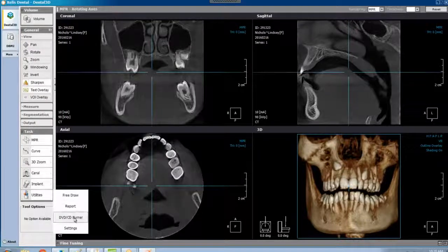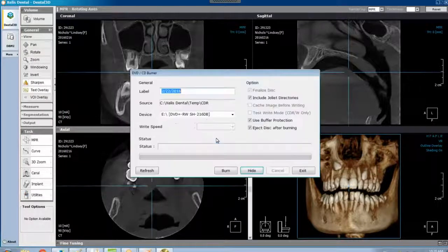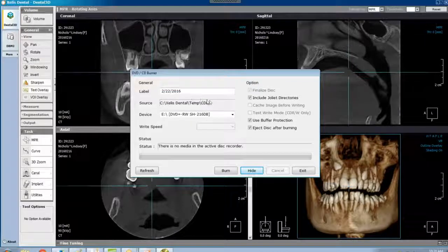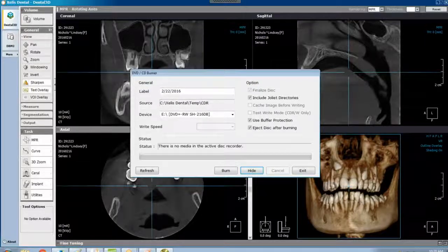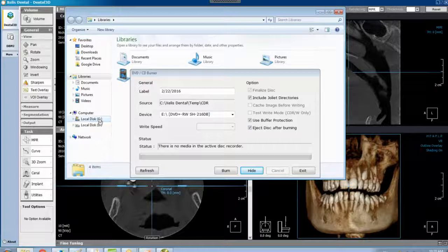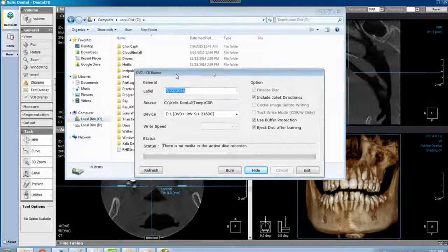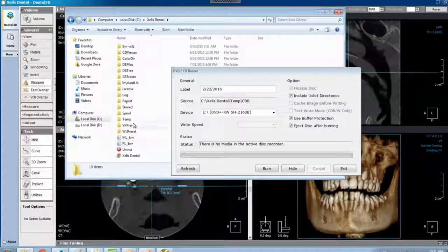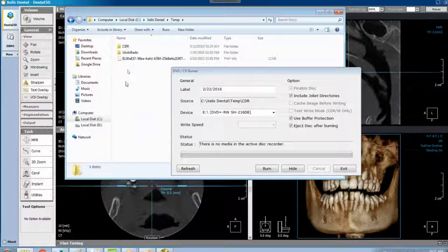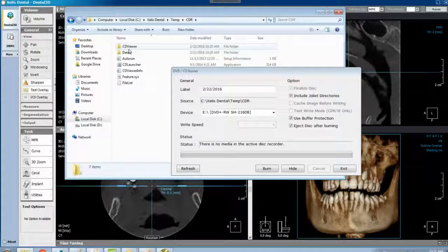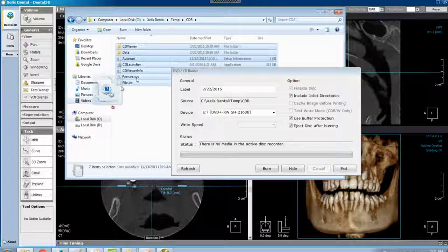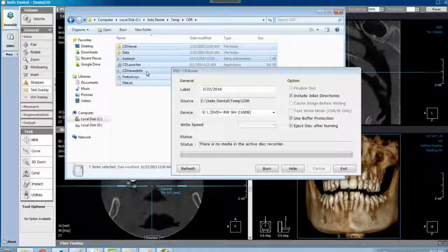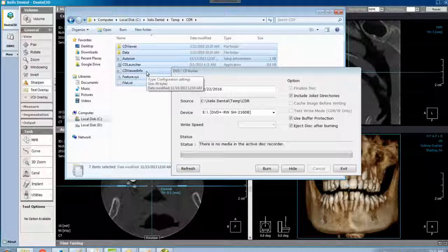Utilities, DVD burn, yes I do. Then go to the source, libraries, C drive, Zealous Dental double clicking, Temp double clicking, CDR double clicking, control A to select all, and then drag those onto your flash drive. For more information, please visit our website at leddental.com.